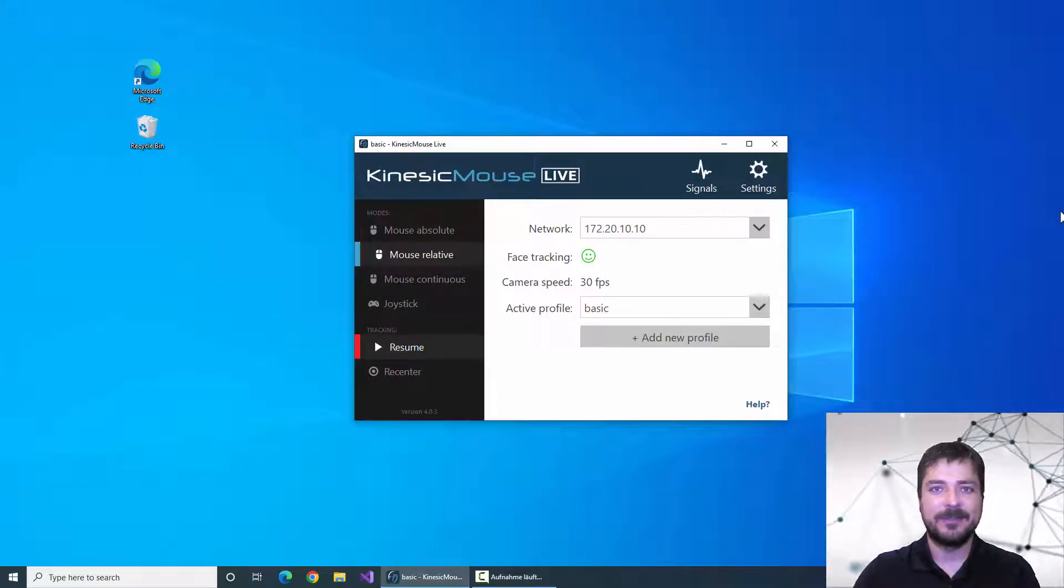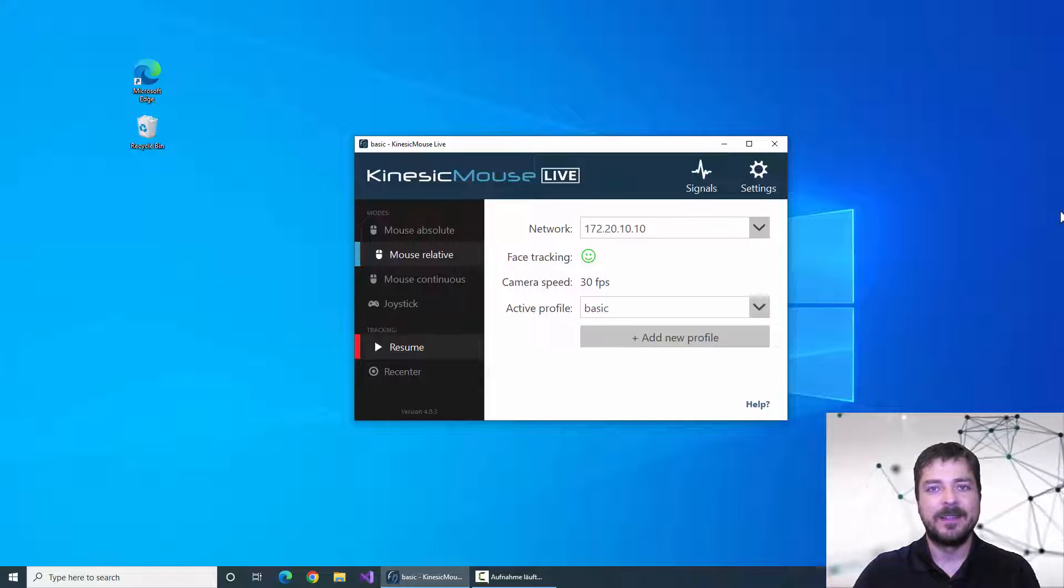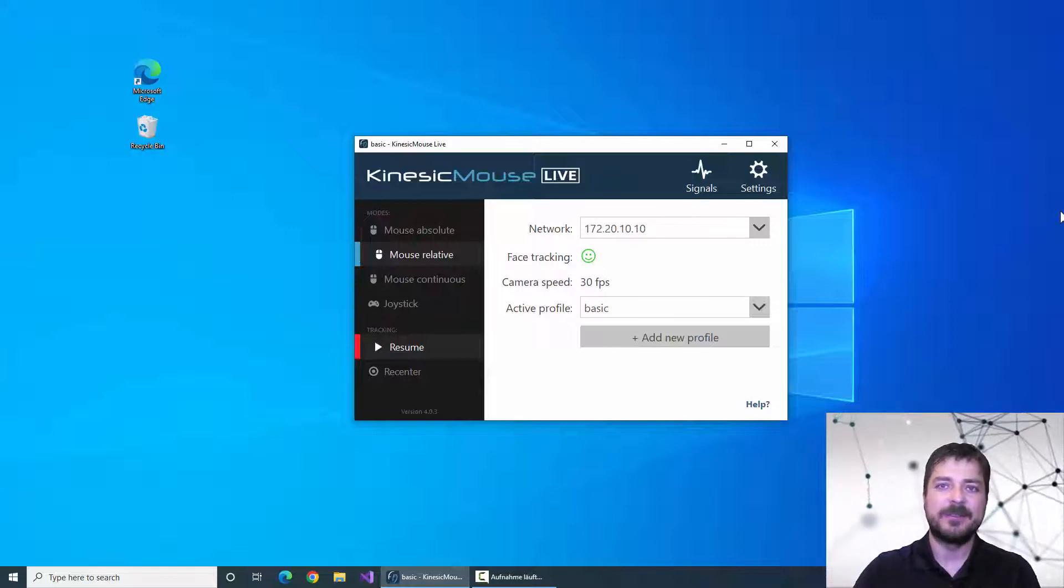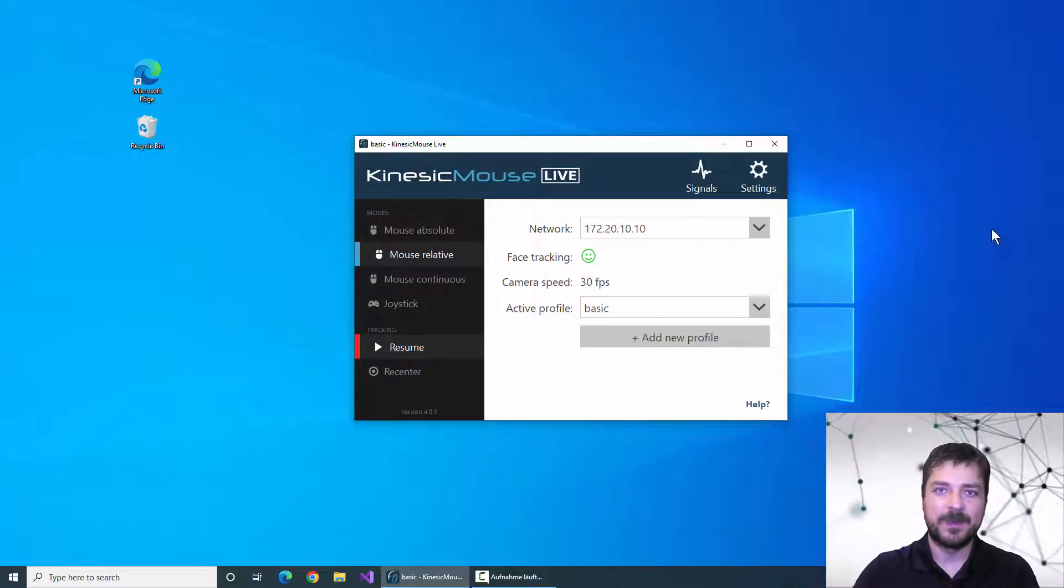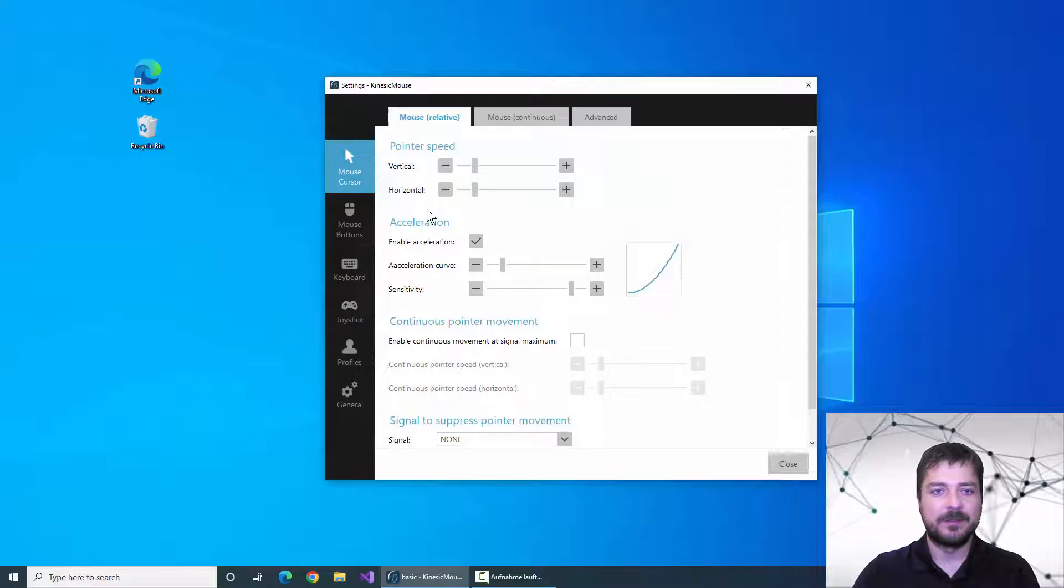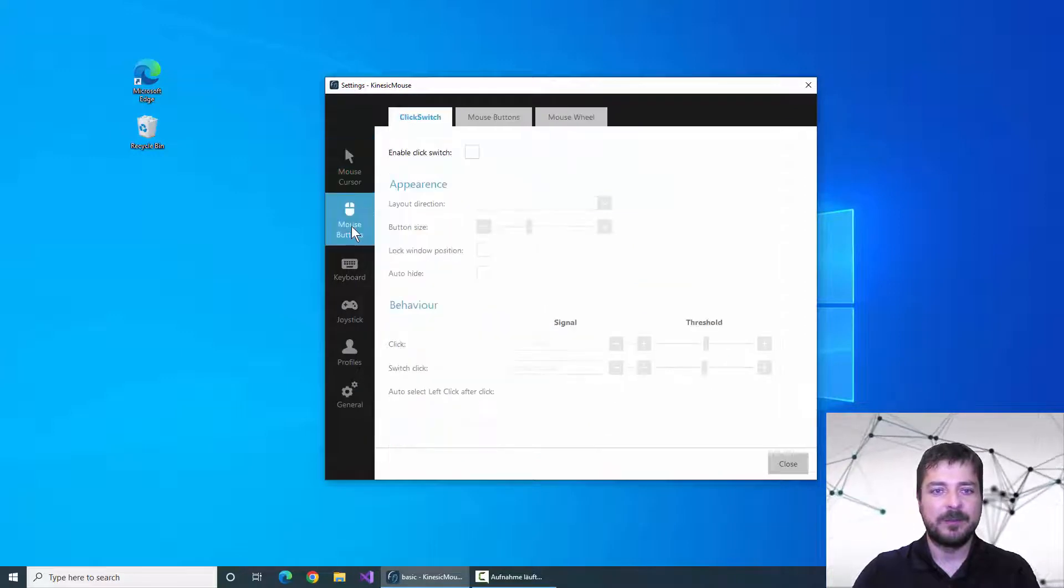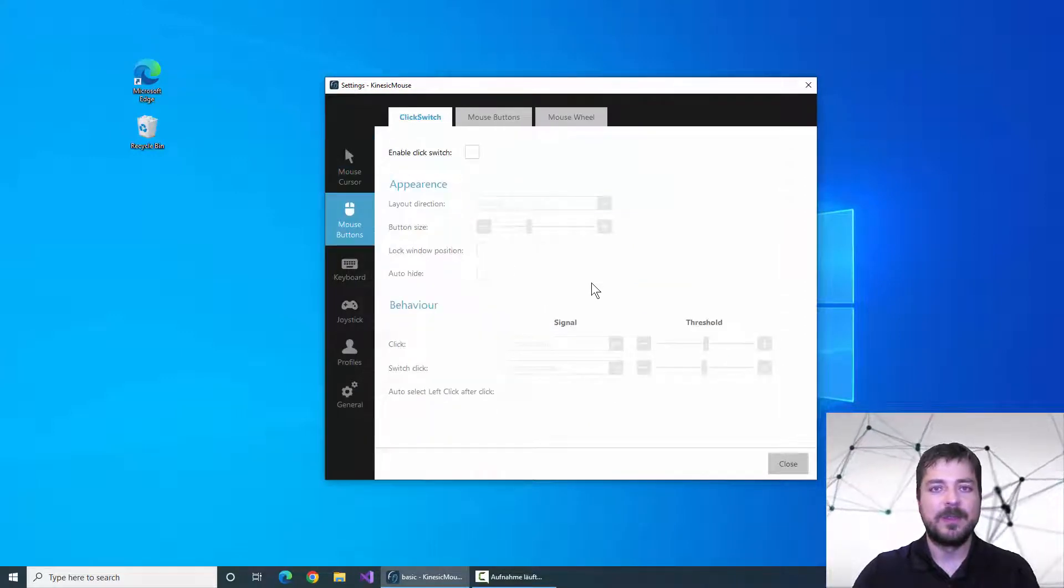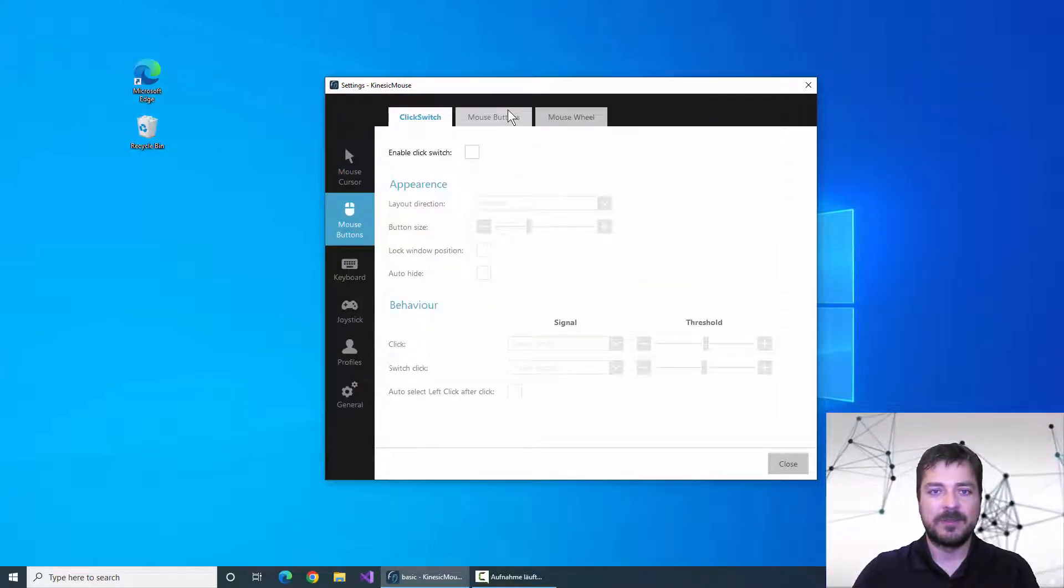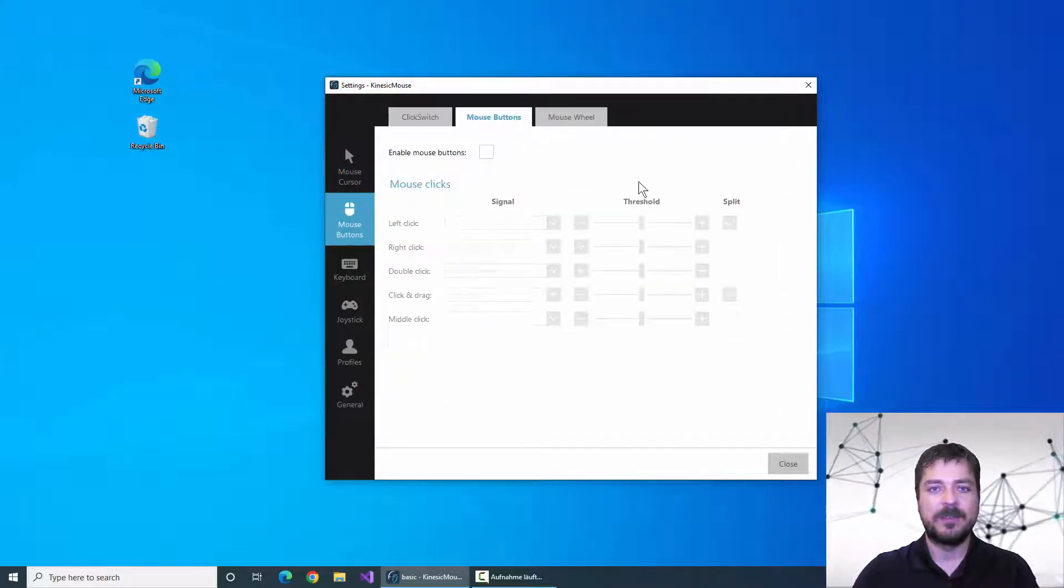So let's take a look at the settings, how we can enable the click switch menu. First we go to settings, mouse buttons, and then I recommend to switch to the mouse buttons tab.